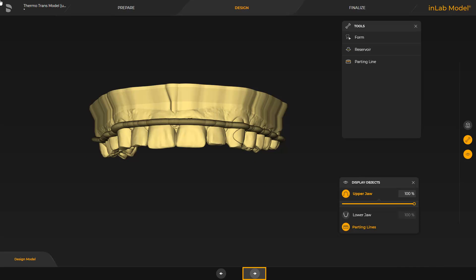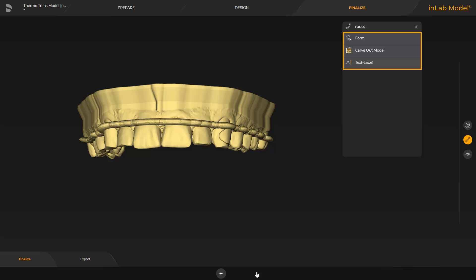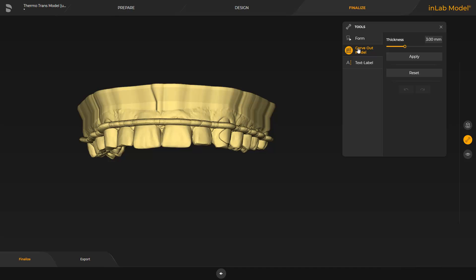Now we switch to the final phase. Again, there are three tools available: form, carve-out model, and text label. It is recommended to create a carved-out model in order to save on resin material. The PrimePrint model T material has a high level of strength and temperature stability, so it keeps its form even when carved out. By tapping Apply, the model is carved out according to the specifications.